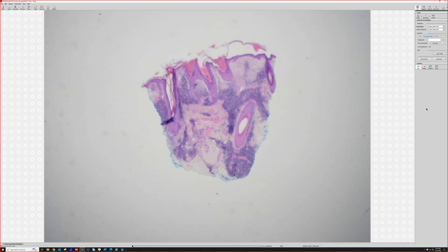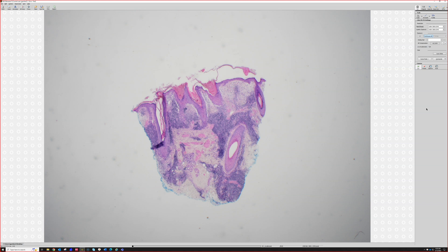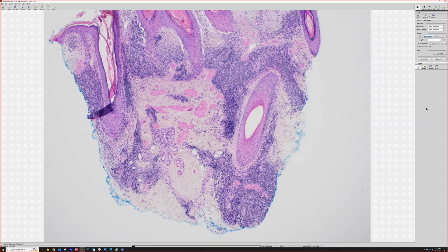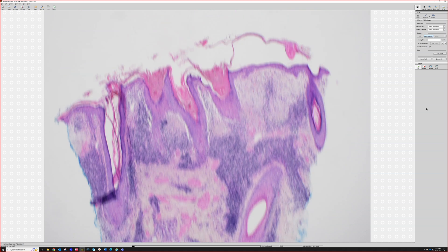At low magnification, the first thought is a broad differential. Lichen planopilaris, lupus erythematosus, and to some extent CCCA — central centrifugal cicatricial alopecia — can all have overlapping features on the scalp: fibrosis and inflammation. That pattern mixed with the clinical context can help sort them out. Here, though, we're probably on the face or possibly the trunk, not the scalp.